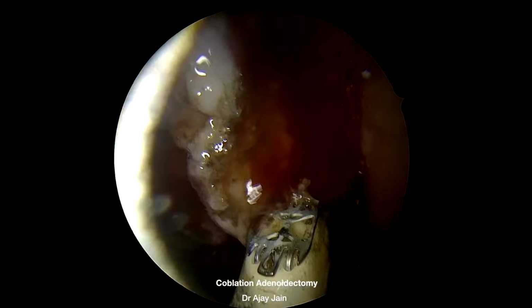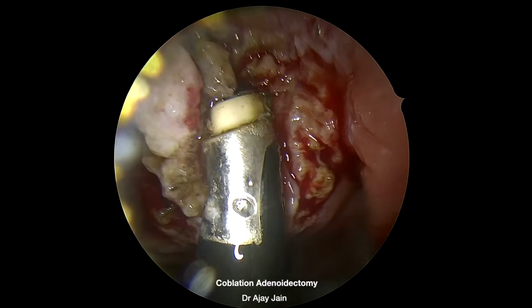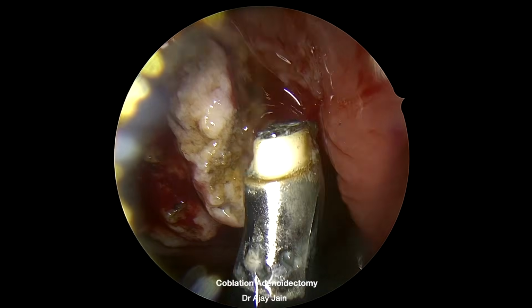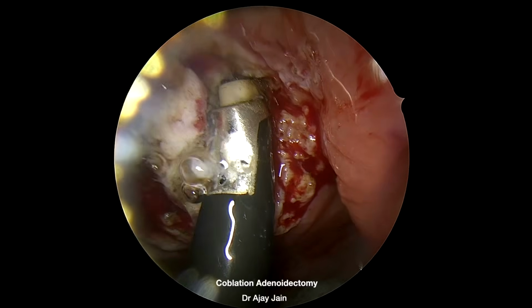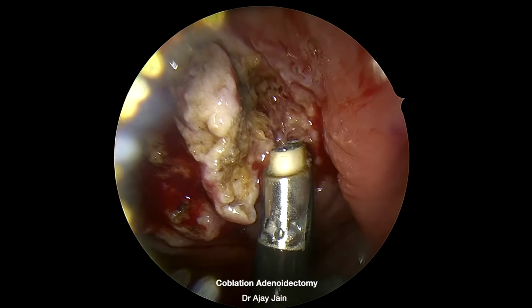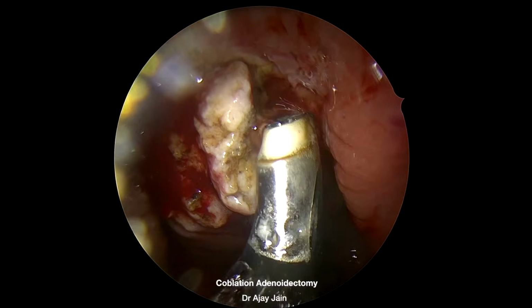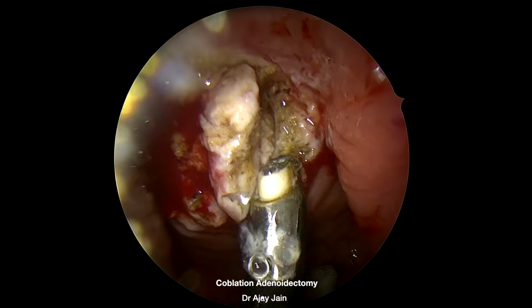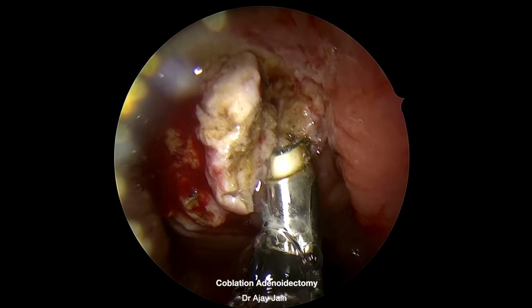Now here the bleeding is happening, but I just want to debulk it so that I have a better view of where the bleeding is happening. But it's continuously filling, so I'm trying to coagulate. Now slightly less bleeding. The good thing is irrigation, which is keeping the field clean. See, bleeding is less now.